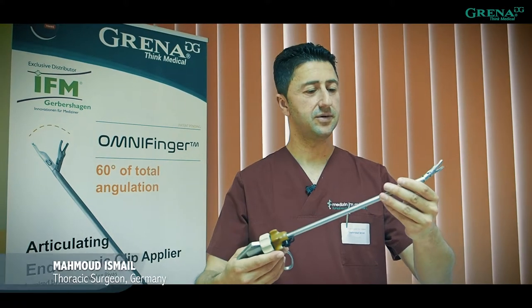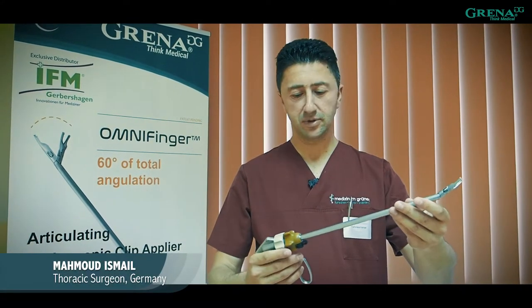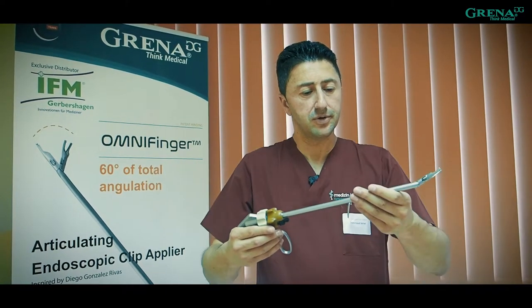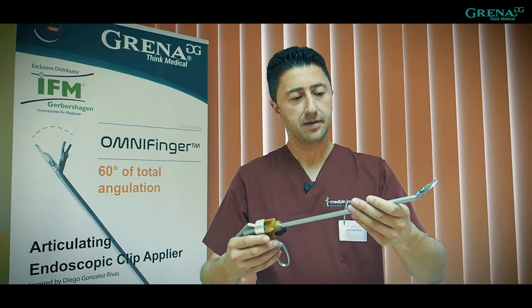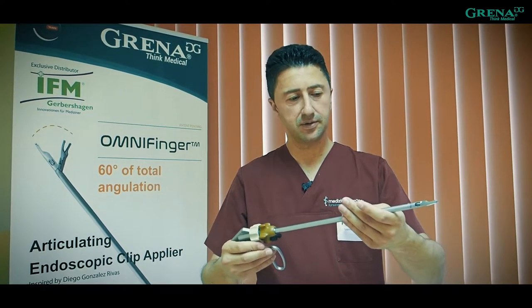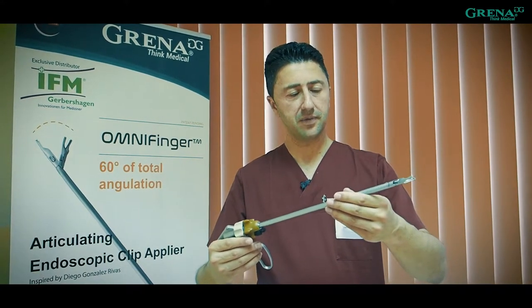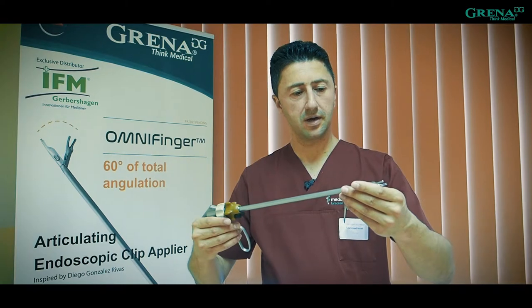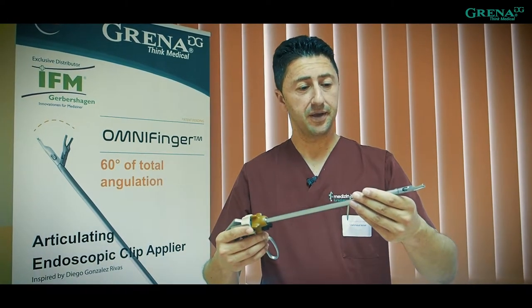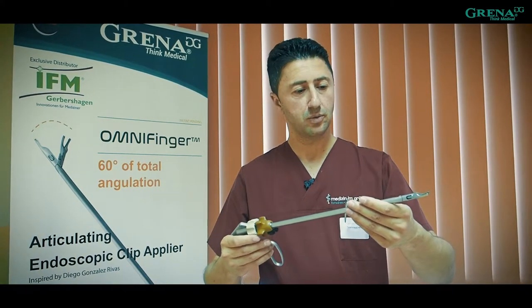As you can see, this is a new clip applier from Greiner's OmniFinger, which really seems to approach exactly what we need. You can use it in several ways — with a trocar or for uniportal surgery. I think it will be a revolution using this applier.